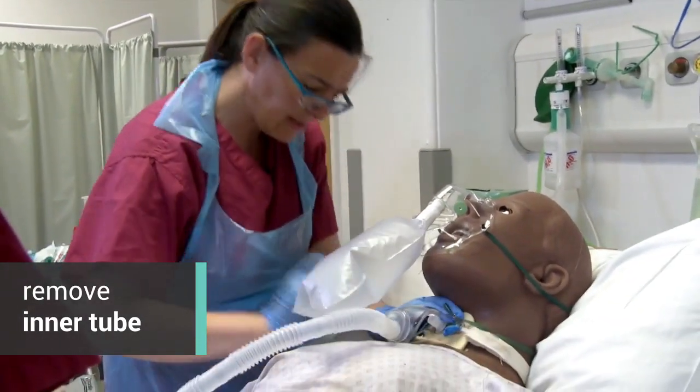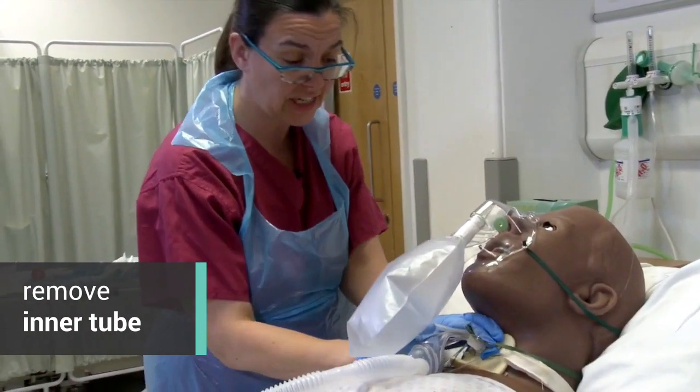Just take some deep breaths for me, Robert. Let's have a look. That's absolutely clear. I only changed it a little while ago.